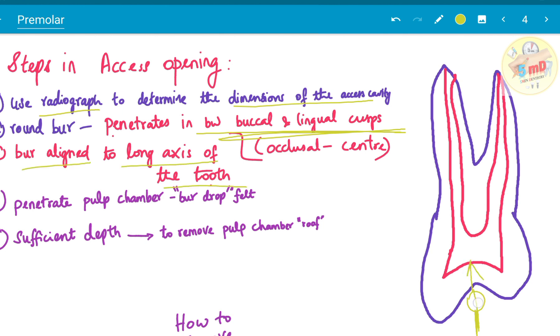Start in the center. The burr is aligned to the long axis of the tooth. As you move inside and once you reach the pulp chamber, you feel that burr drop. When you penetrate the pulp chamber, you feel the burr drop. And sufficient depth is reached to remove the pulp chamber roof completely.